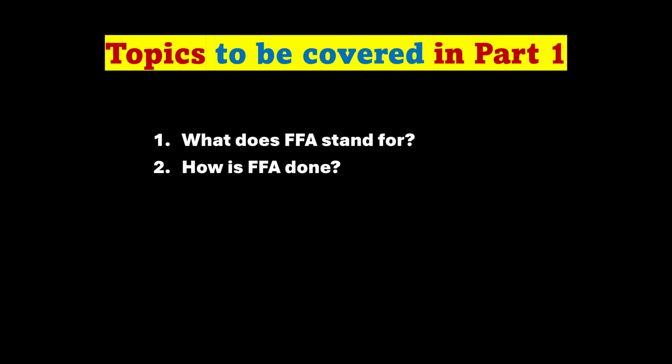So in this first part, I will try to cover three questions, or try to answer three questions. What does FFA stand for? How we do FFA, and how we interpret FFA in our clinics.